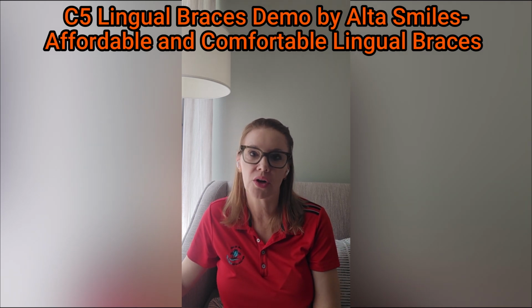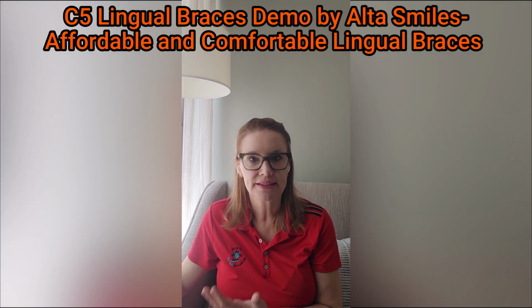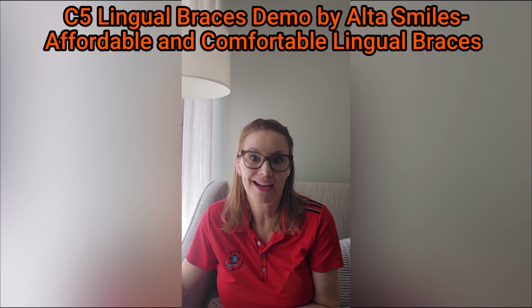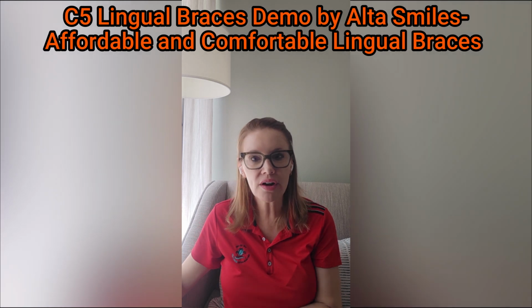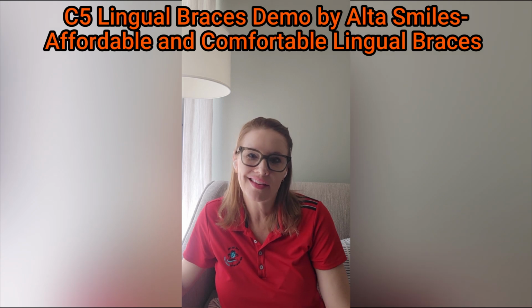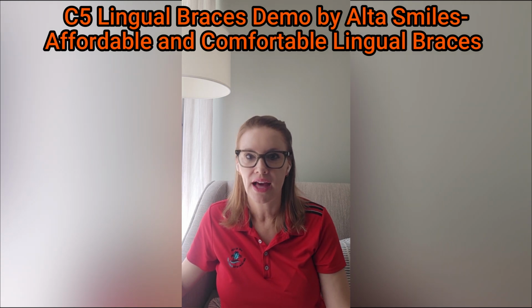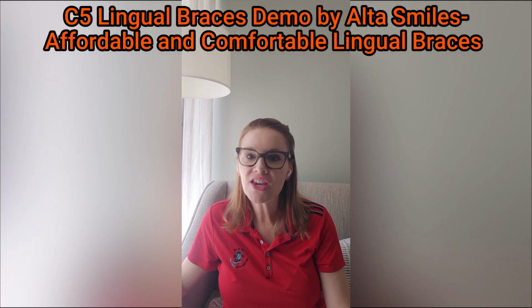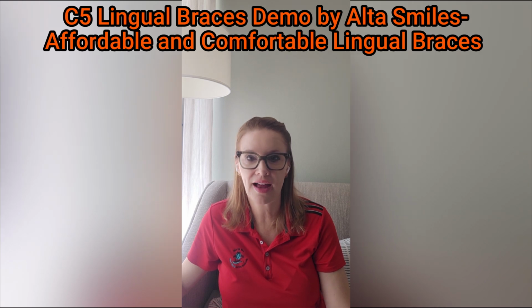Nothing wrong with it. It really works in places like Manhattan and places where people are very aesthetic conscious, and in jobs where maybe they can't even have attachments showing. And of course, there are aligner companies that have fewer attachments, higher trim lines, everything like that. I think now with Invisalign and clear aligners, for the most part, that's less of an issue than maybe it was 10, 20, 30 years ago. But there are some people who refuse to have attachments on their front teeth, which I understand. They're kind of ugly sometimes, especially if people don't shade match them.